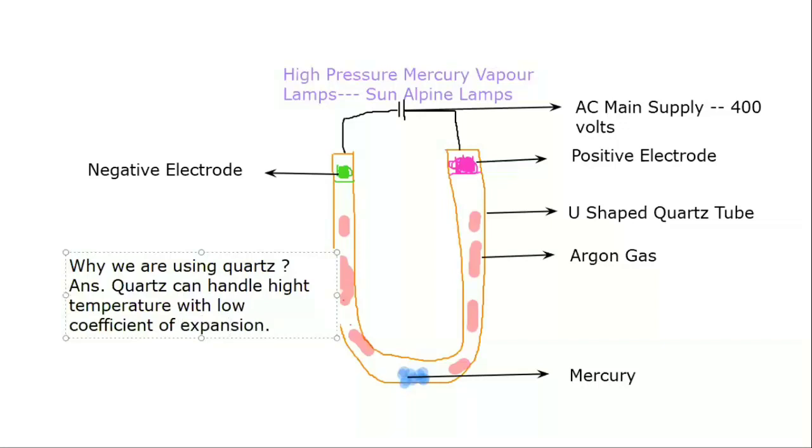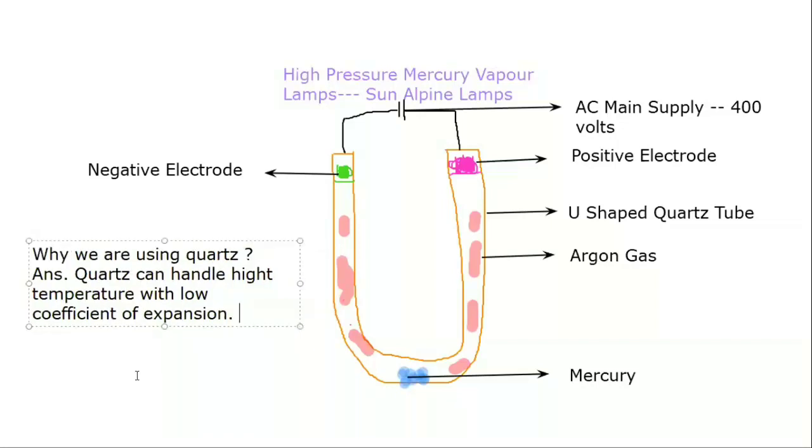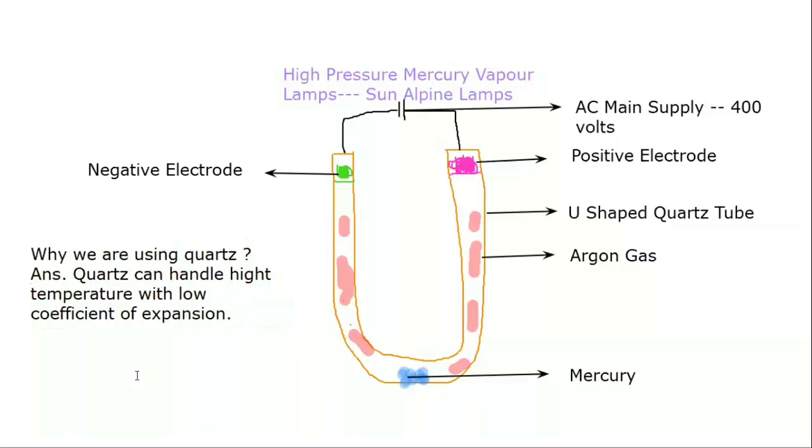Yes, so that is the reason we are using quartz. Please make sure you understand this phenomenon. It is a very important viva question also.